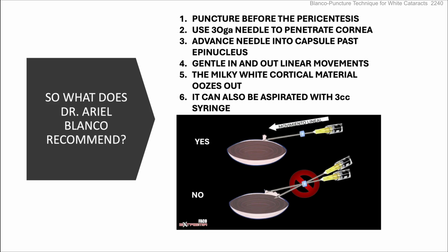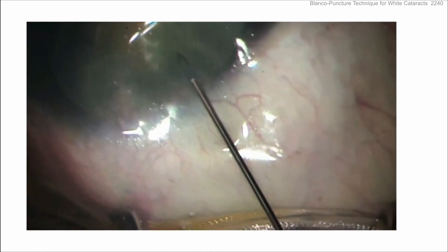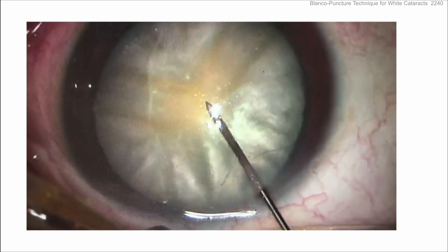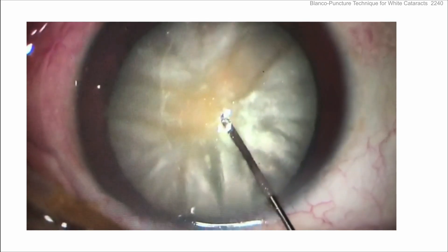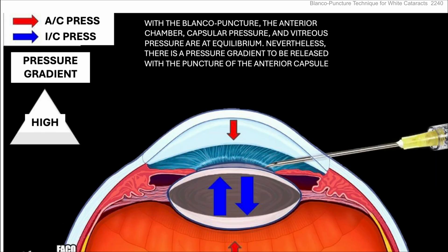He recommends puncture before the paracentesis using a 30-gauge needle to penetrate the cornea at the limbus. Advance the needle to the capsule, past the epinucleus, then go in and out — back and forth. If needed, you can also aspirate with a syringe. No paracentesis, no viscoelastic in the AC — just poke into the lens capsule with in-and-out linear movements, not sideways ripping movements. This lets the fluid ooze out and depressurize in a controlled manner, bringing the anterior chamber, capsule pressure, and vitreous pressure all to equilibrium.